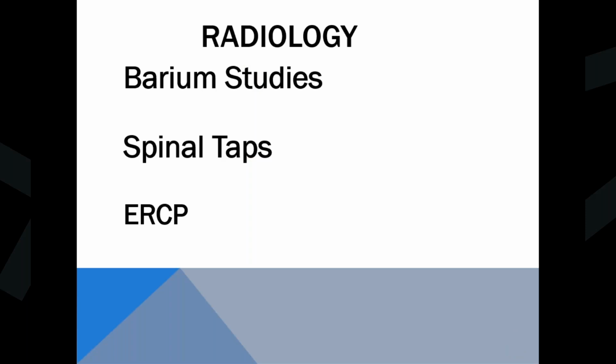Some of the areas that you might see, if you don't work around the OR or vascular areas, is in radiology, where they'll use the machines for barium studies. You'll have your barium swallow, and then you'll have your barium enemas. They'll also use them for spinal taps or other guided needle procedures, and for ERCP.